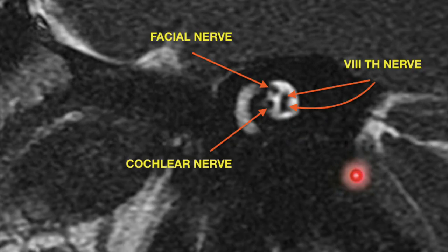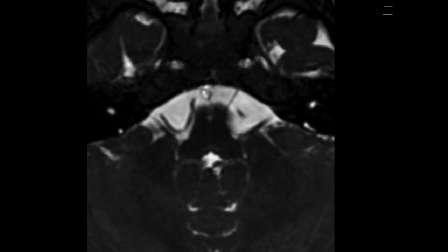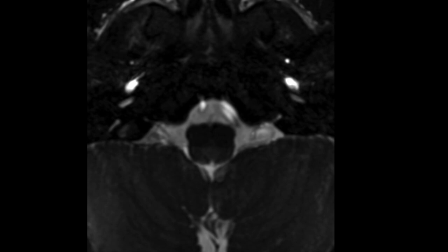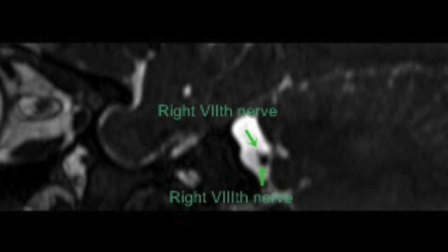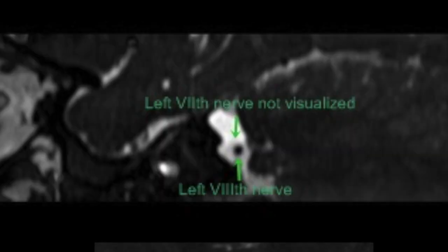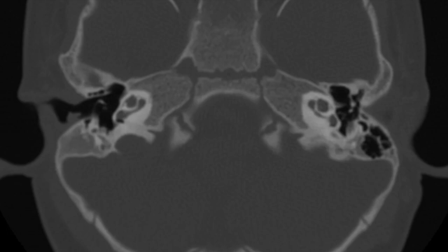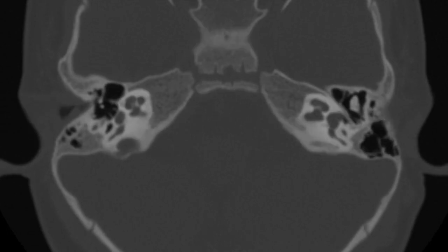In our case, it is difficult to visualize the facial nerve on axial FIESTA sequences. However, on sagittal recon, a thin linear structure is seen accompanying the right 8th nerve in the cisternal segment, thus confirming its presence. On the left side, it is absent.